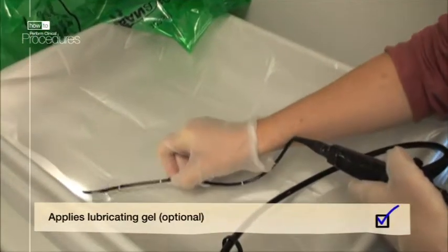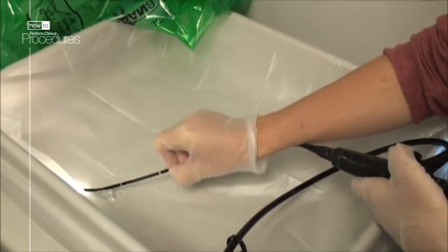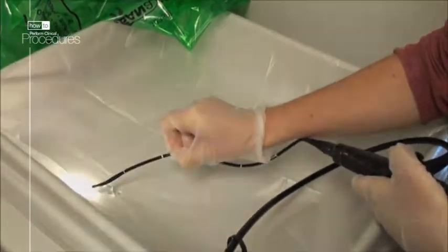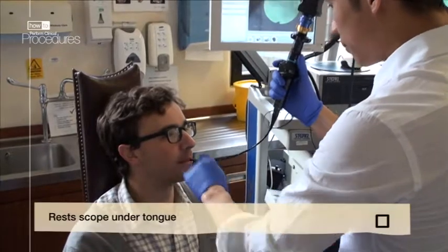If you wish, apply some lubricating gel to the end of the scope. Many practitioners prefer using the patient's own saliva as a natural lubricant, which is also an excellent anti-mist solution. Rest the tip of the scope below the tongue for 5 to 10 seconds, which also acts to warm the tip.